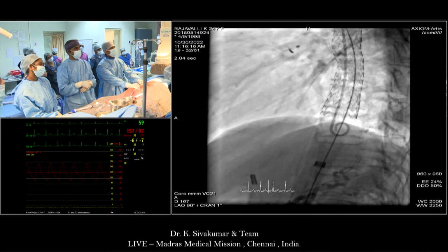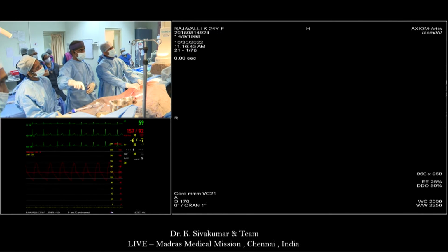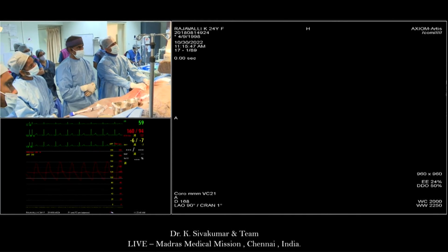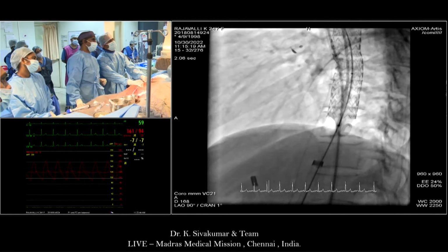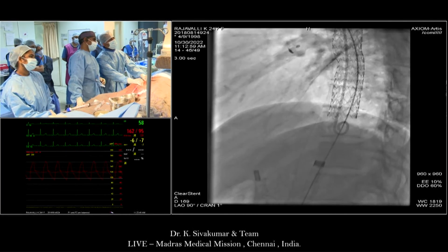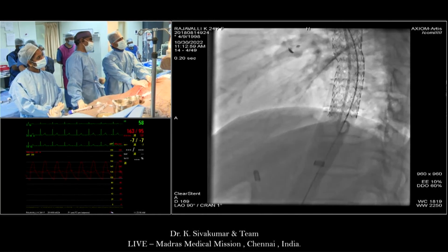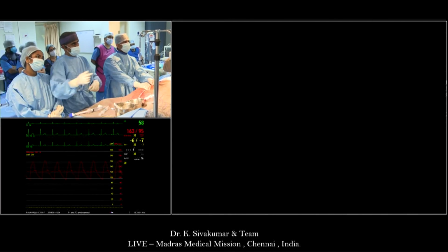Yeah, this was the lateral view. Here we can see that the distal end was not opposed, and we were able to see the contrast extending into the dissected flap a little bit above, but we got it totally abolished with a Tyshak balloon.